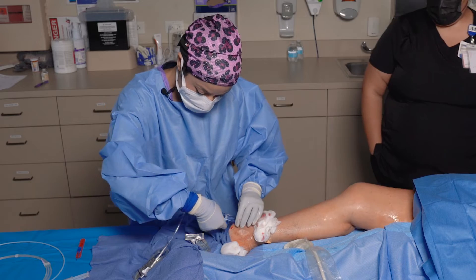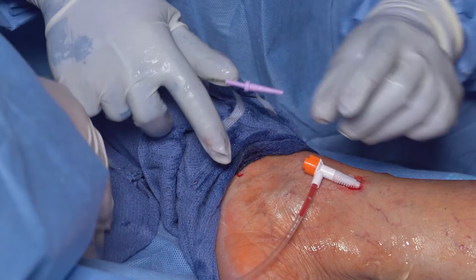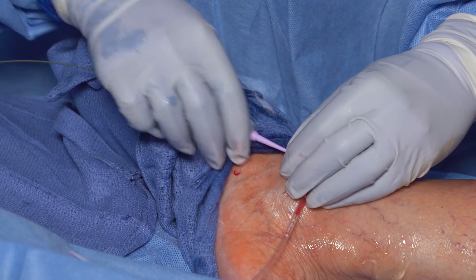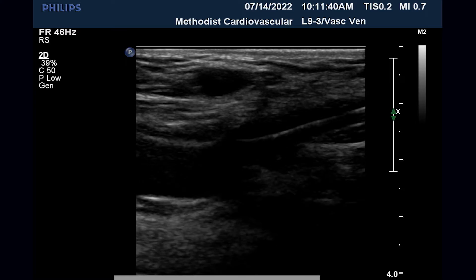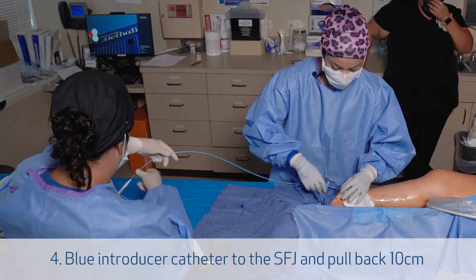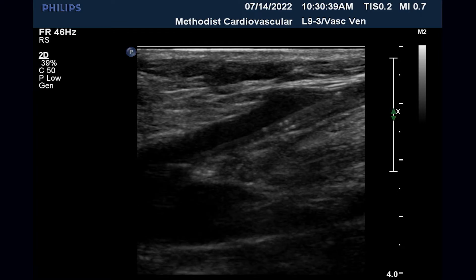I then switch out for the 7 French sheath that comes with the kit. Now I'm putting the green wire up through the sheath using short throws, making sure that it's passing easily. I want to visualize that wire at the tip at the saphenofemoral junction. Once we're satisfied with our view and the wire is in the correct location, we can pass the blue catheter over the wire up to the saphenofemoral junction.